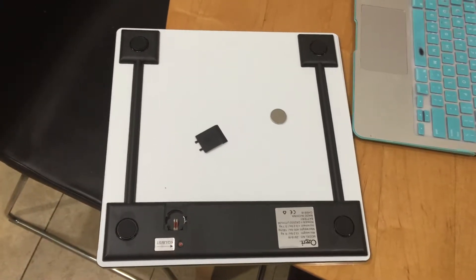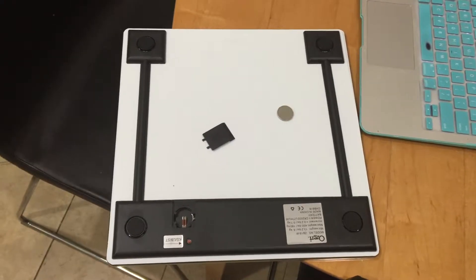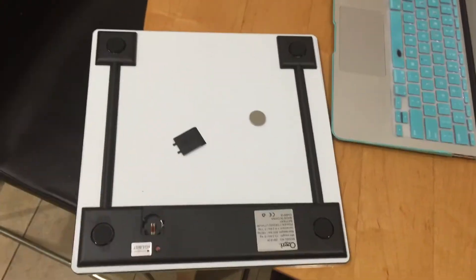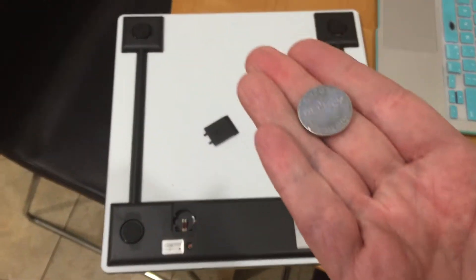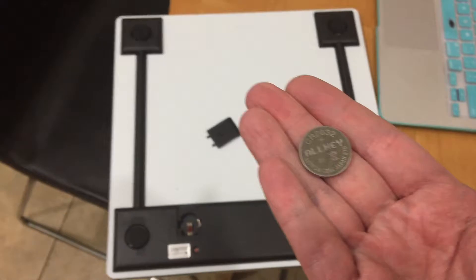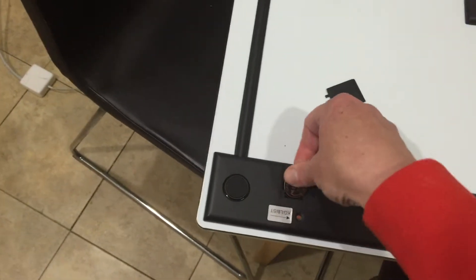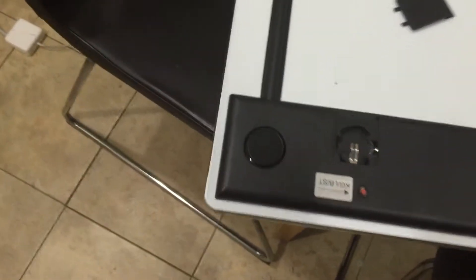This is a video review of the Ozeri bathroom scale. The scale came with the battery not inside of it, which I kind of like because it means the battery will last longer. It operates on a large watch battery that goes in a compartment. This is my first time putting the battery in and trying out the scale.